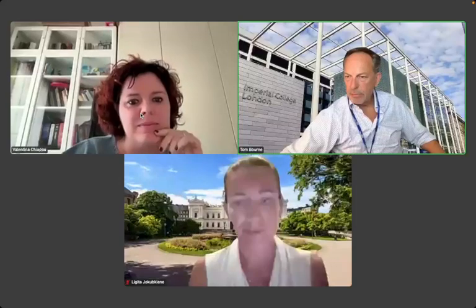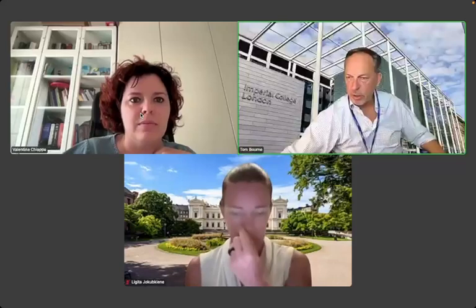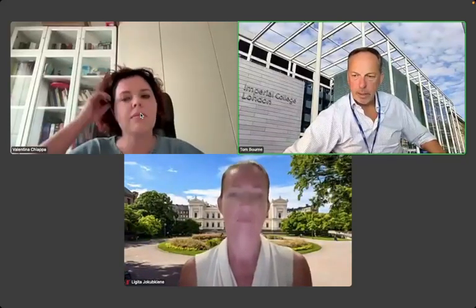I'm just looking here to see if we have any questions. I'm just going to address one question, which is about the availability of the Adnex model online. And I think I can answer that if that's okay. The answer is it's not available online at the moment. It's available on the machines, or some machines, including Samsung. And the reason it's not available online is the introduction of medical device regulation in Europe, and it's a change which I think is quite a profound change, actually.